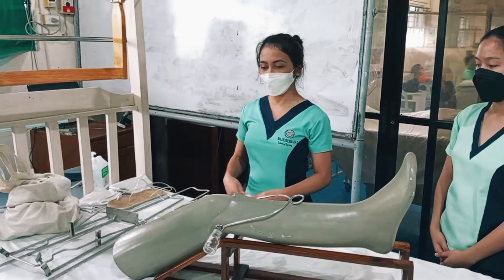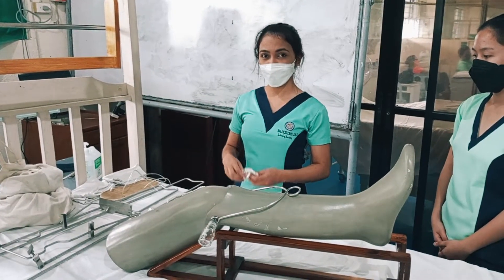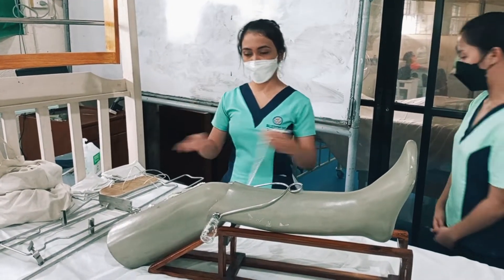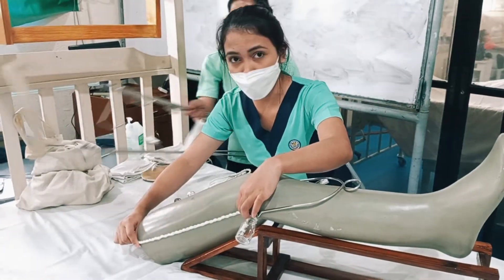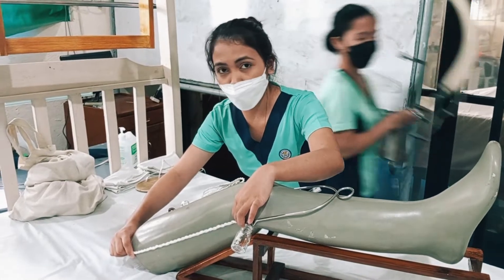First, you need to measure the thigh of the patient using the short rope or the thigh rope. This measurement will serve as your basis for positioning the Pearson attachment on the Thomas splint.